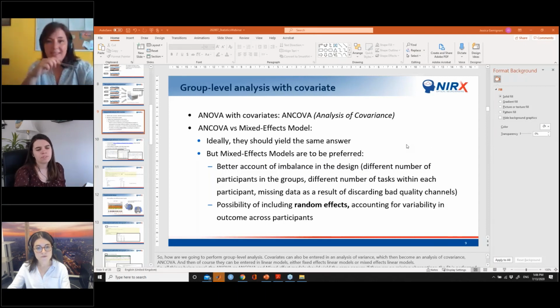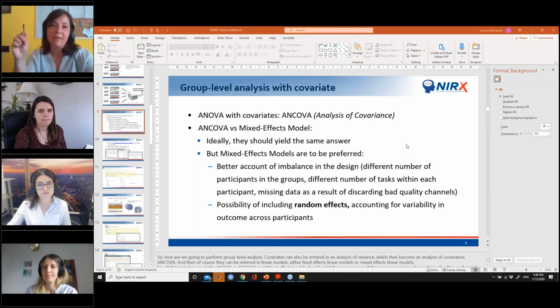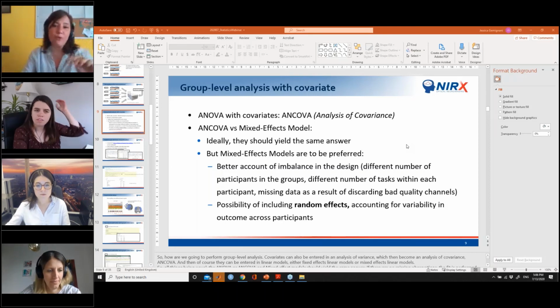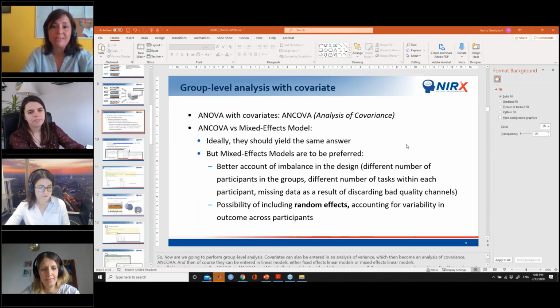So basically the slope is the same. Let's say you have condition 1 and condition 2, and the activation is always higher for condition 2 than for condition 1. Then each subject will have a different starting point, but for all of them, condition 2 will have a higher activation than condition 1. This is a random intercept. You are allowing the subjects to have different starting points.